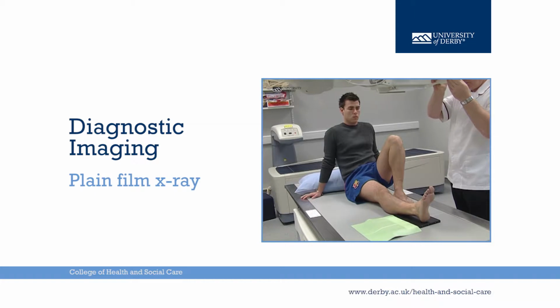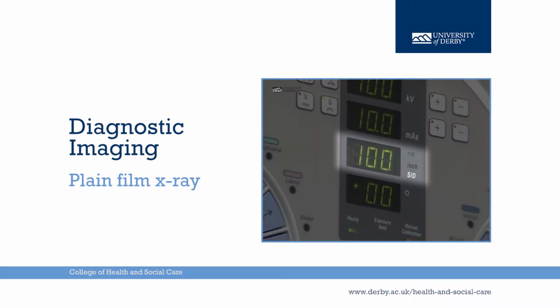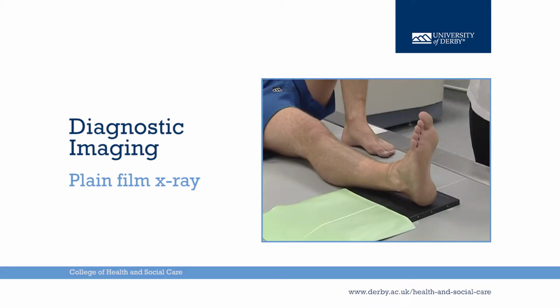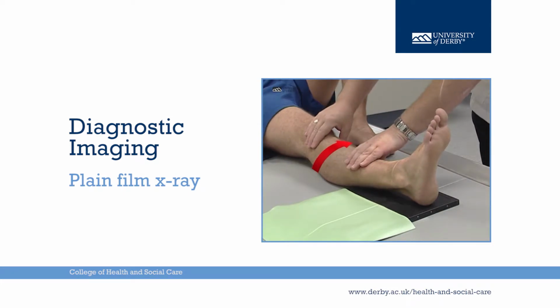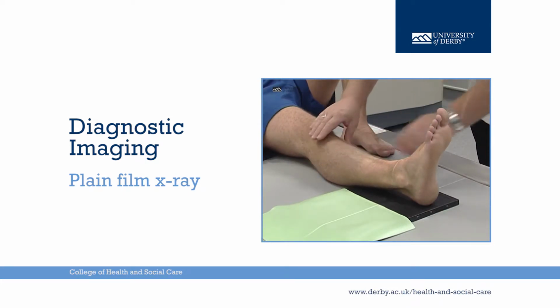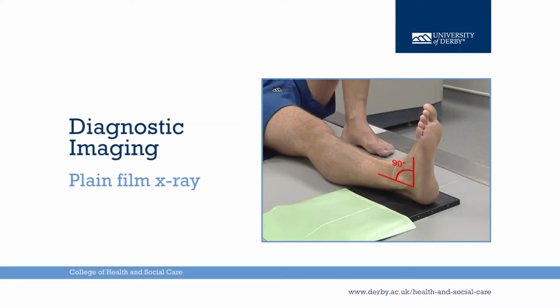The X-ray tube is positioned to an FFD of 100 centimetres and centred over the ankle joint. The lower leg is medially rotated to bring the medial and lateral malleoli equidistant from the imaging plate. The ankle joint is dorsiflexed to 90 degrees by asking the patient to pull the toes towards the trunk.